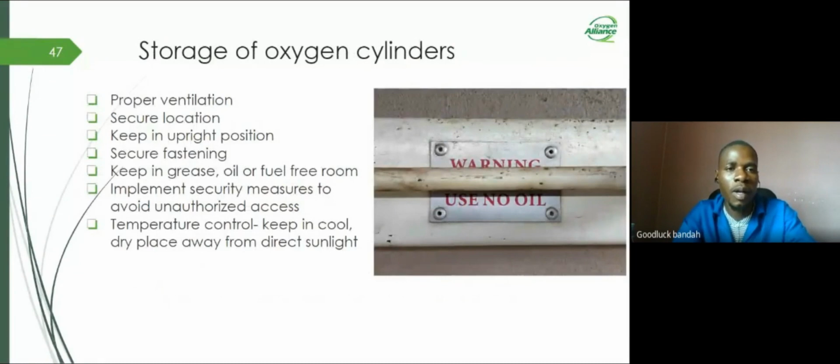Now, let's look at the storage of oxygen cylinders. Whenever we are storing oxygen cylinders, it's important that we have proper ventilation. We should keep them in a secure location. And as already said, it's important that we always keep them in an upright position. And of course, they should be securely fastened. In this case, you can use chains to securely fasten them.